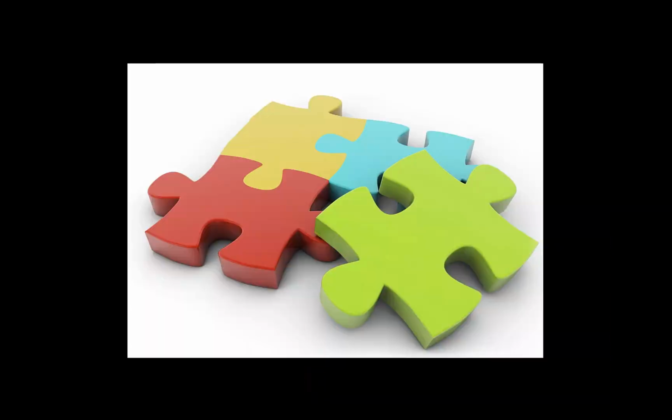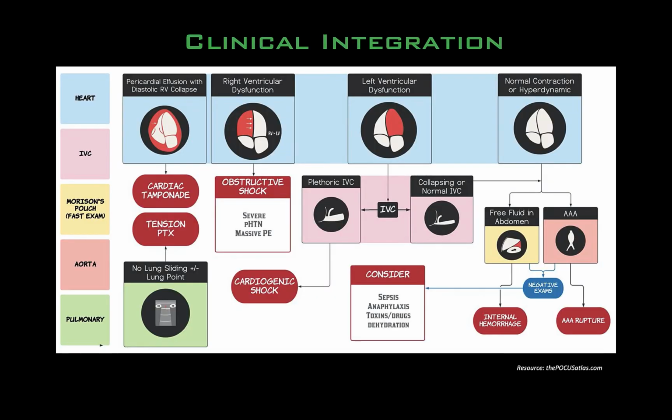That was a lot of material. Thank you for sticking it out. At this stage, I recommend that you go back and review any necessary slides so that you are comfortable with the sequence and specific questions you are trying to answer with the RUSH exam. Perhaps the biggest challenge is putting all of these pieces together quickly to develop a focused differential for the unstable patient, and thus, clinical integration is key.